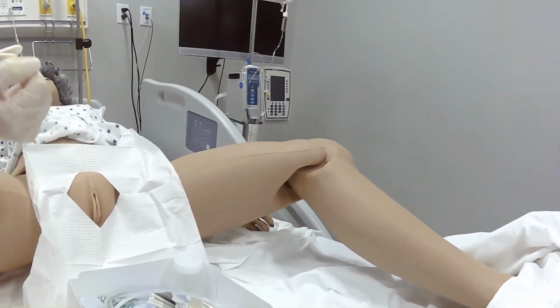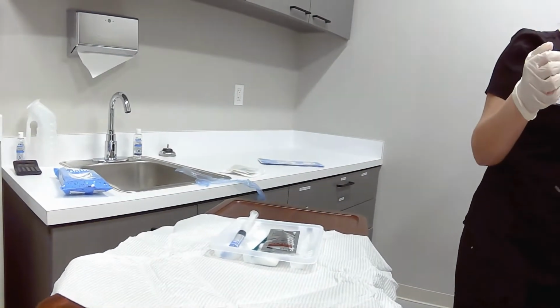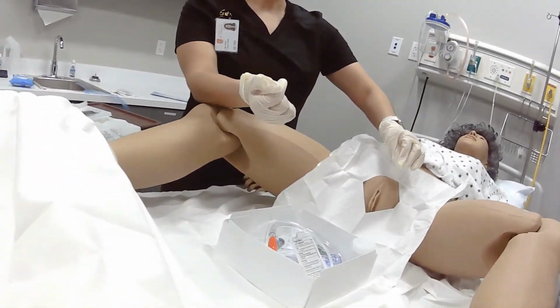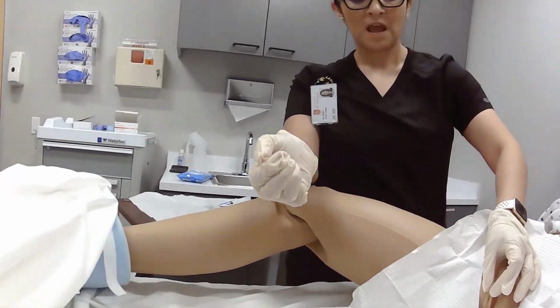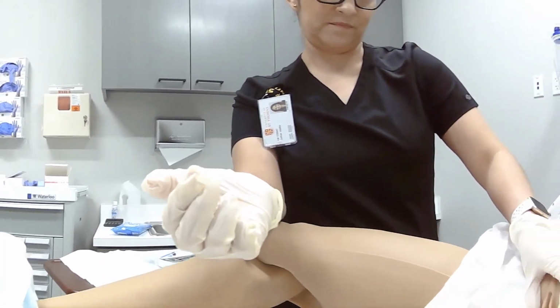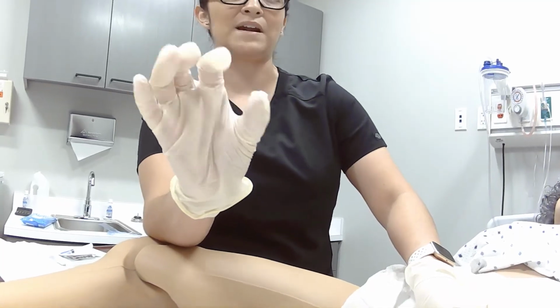So Miss Adams, we're going to get ready to start. I'm going to touch your private region, your genitalia here, and we're going to get started to clean the area. Okay, just like we did earlier for the perineal care, I'm going to spread open the labia. My left hand is my non-dominant, which is now my non-sterile hand. Everything that I need to touch with my sterile glove will now be with my right hand.